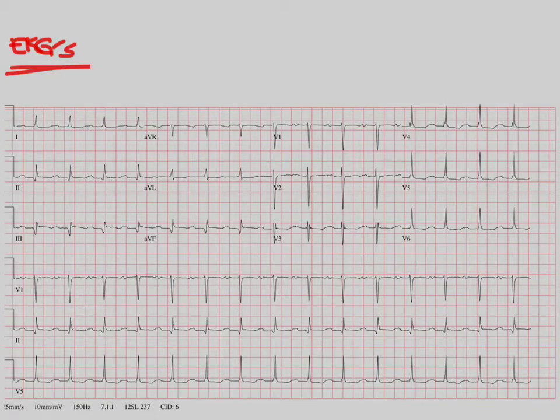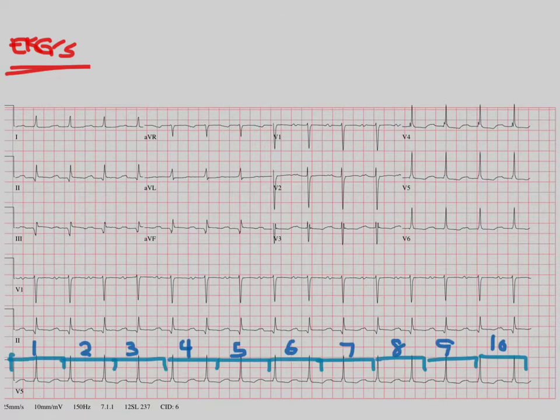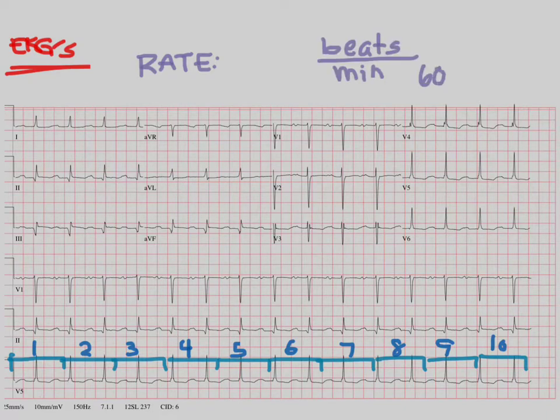If you come back to the big EKG here, you would see that if we break it up into several five-block one-second segments, we would have 10 of them. So an entire EKG is 10 seconds total. Now we're ready to look at the first thing we want to measure on an EKG, and that's the rate. Rate is measured in beats per minute, and a minute is 60 seconds. We know this EKG is 10 seconds in length, so to get a minute we would have to have six of these. One way to calculate the rate is to count how many beats are in this EKG and multiply by six.